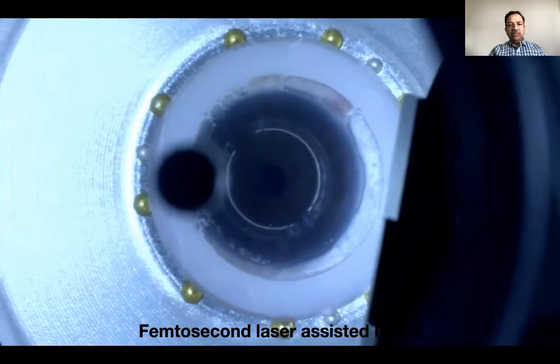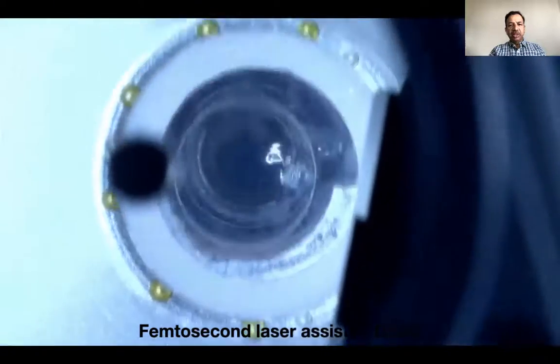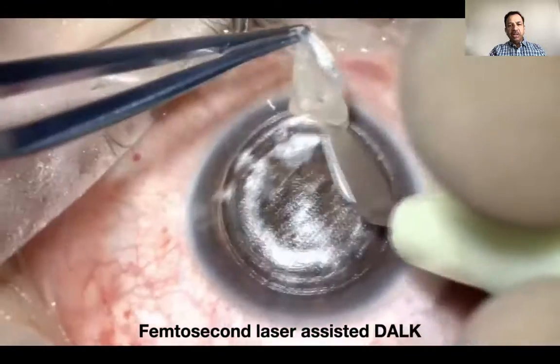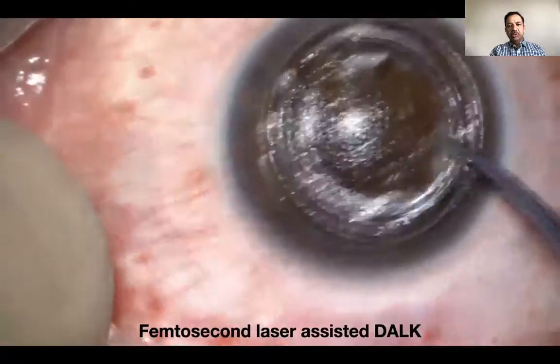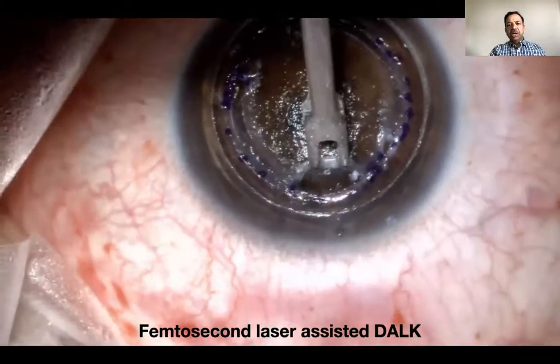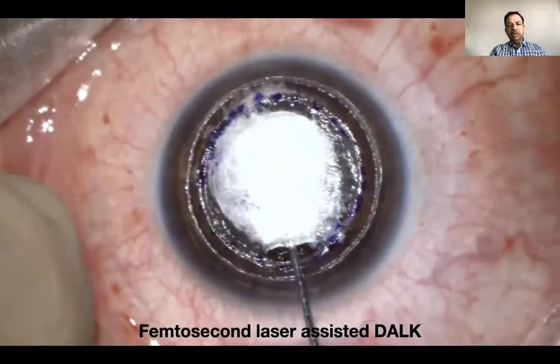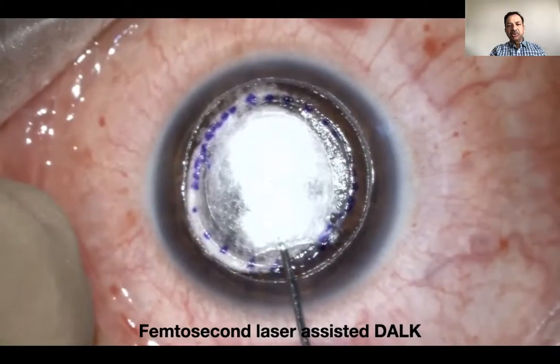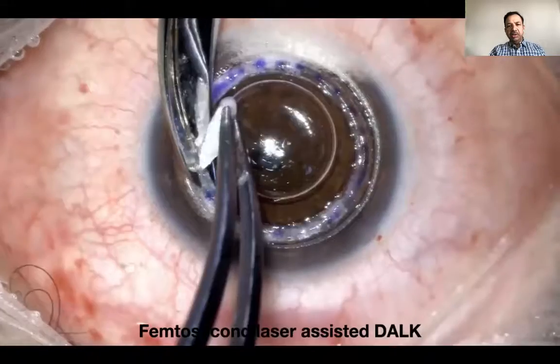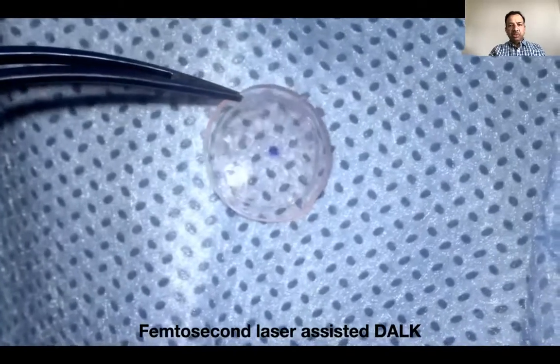So this is a case of a patient who has intracorneal rings where we had planned a femtosecond laser DALK. The anterior diameter is larger, the posterior diameter is smaller. This is a mushroom-shaped incision. The rings are removed, and then we go ahead and inject air to create the big bubble. The diameter of the big bubble basically has to be large enough to cover the posterior cut diameter. And the donor is also prepared in the same way.